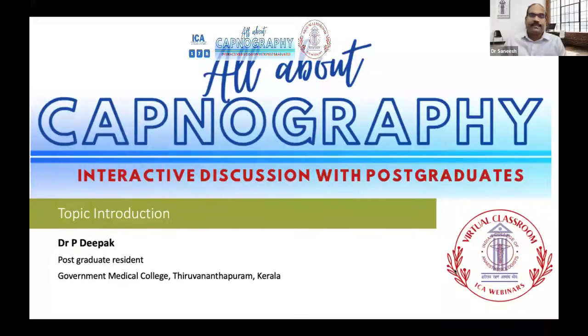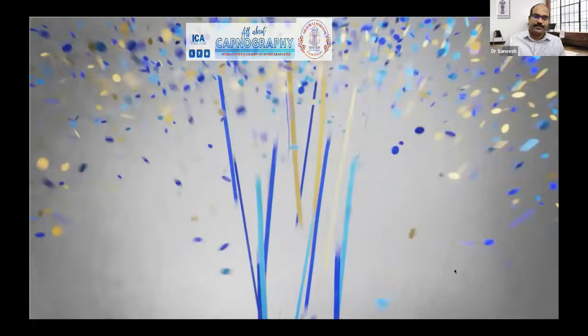In one lung ventilation, definitely the sampling is different, because only one lung is getting ventilated. And even for thoracotomy, the V/Q mismatch is there, the pressure difference is there, the ventilation mechanics are different. So our end-tidal CO2 sampling may not be accurate. In those situations, I think we have to go on arterial blood gas to check the carbon dioxide status.